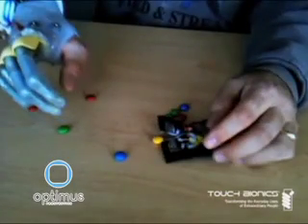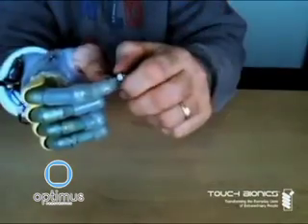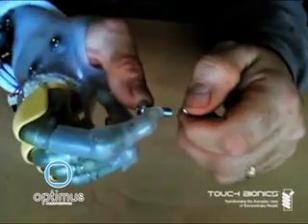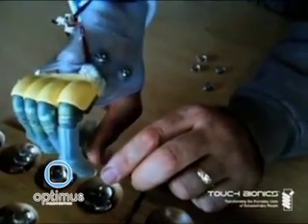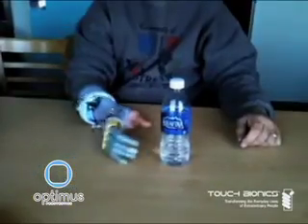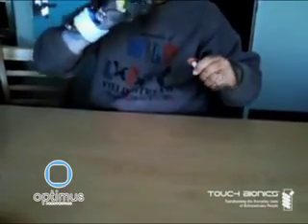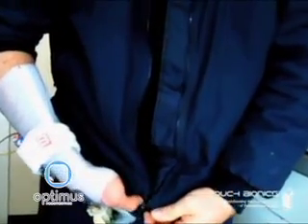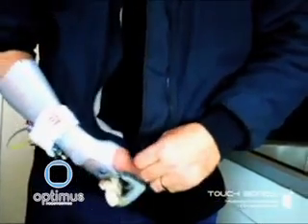With the ProDigits, they actually incorporated a single motor in each finger of the prosthetic hand. So now, when an amputee closes, all five fingers will close around the object and open. So it's a lot more natural grasp pattern. They also have the ability to rotate the thumb to do different pinch and positional force positions to, for instance, pick up a goblet or differently shaped objects that would have been more difficult with old technology. With the ProDigits now, they can do a lot more daily activities that they would have had trouble with.